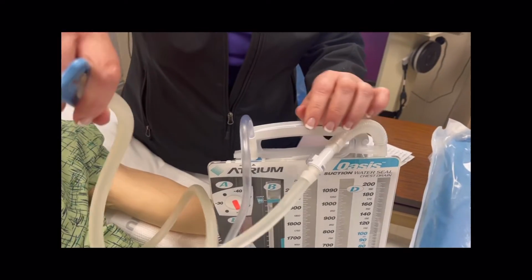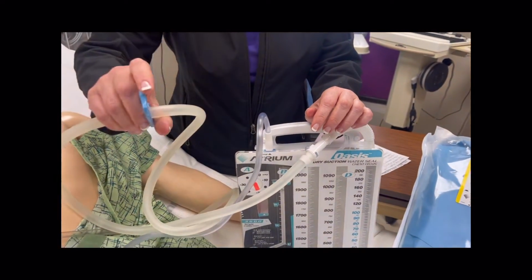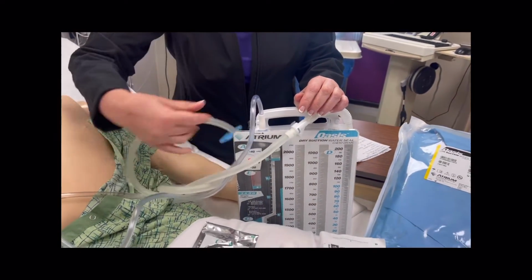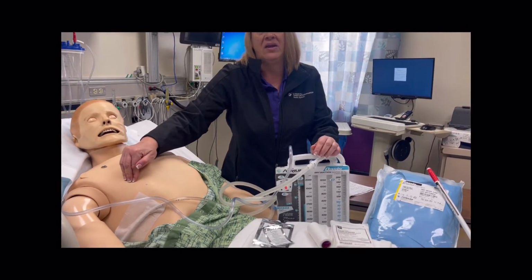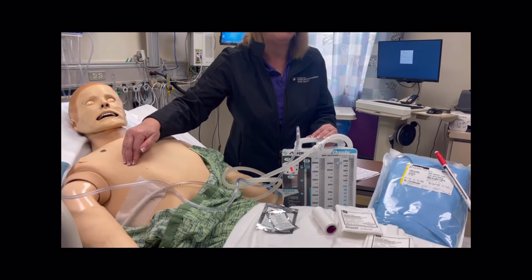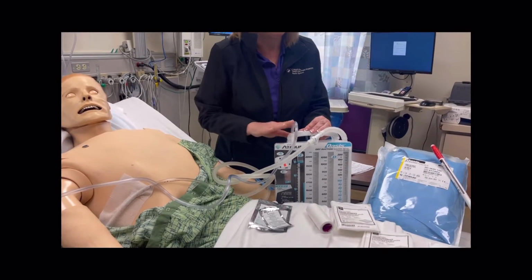Most importantly, you must unclamp. If you do not unclamp this, all of this back pressure to the chest tube and to the lung will create a pneumothorax, as we've already noted, could be potentially life-threatening.